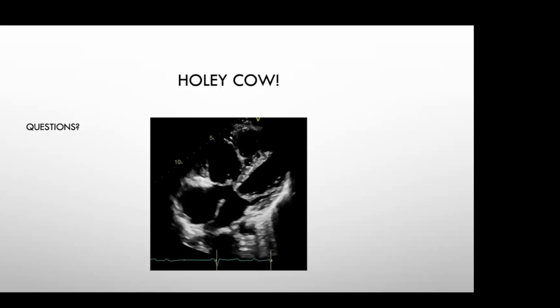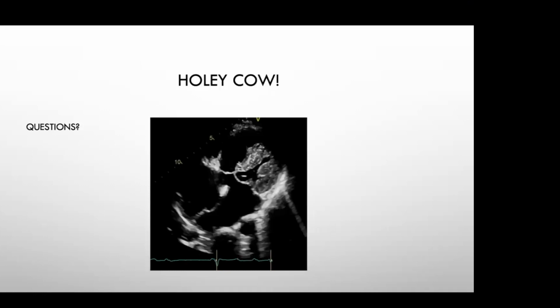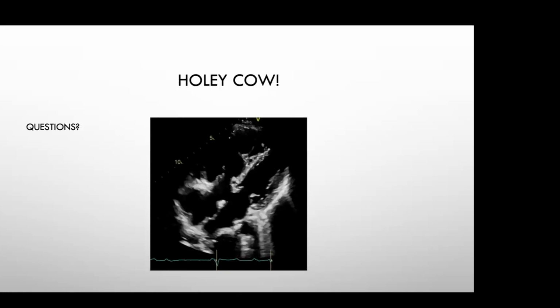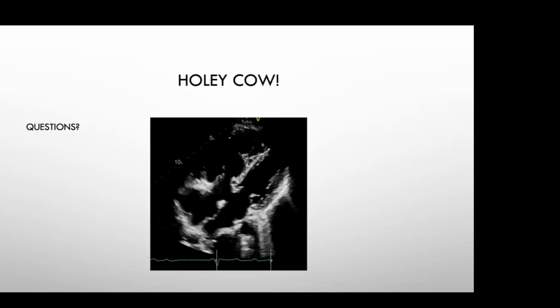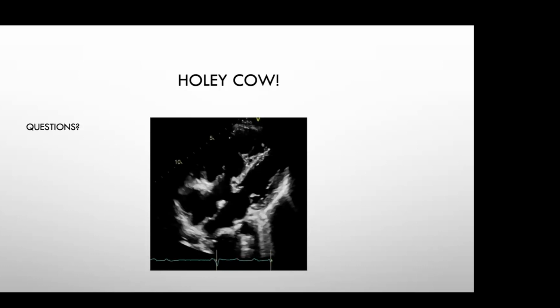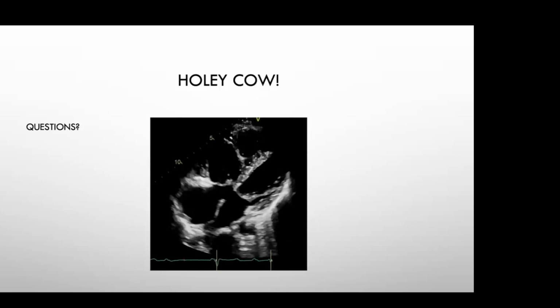Going back to the left foot injection, if you do the right foot injection, will it add more information? The right foot should be the same, because they'll both drain into the IVC together. So only one foot is okay, unless there's something else going on. I don't know what that would be, because I don't think you should have two inferior vena cava.